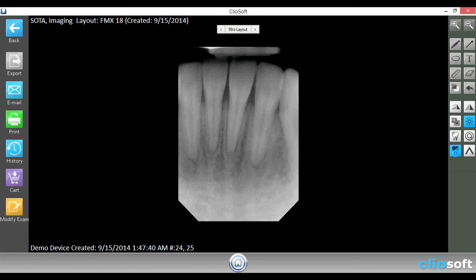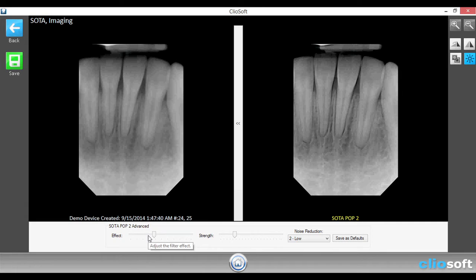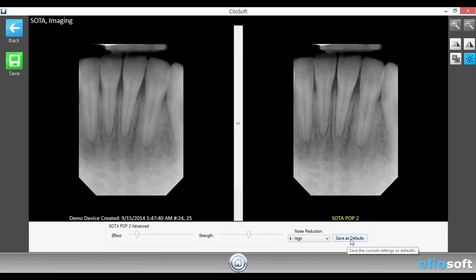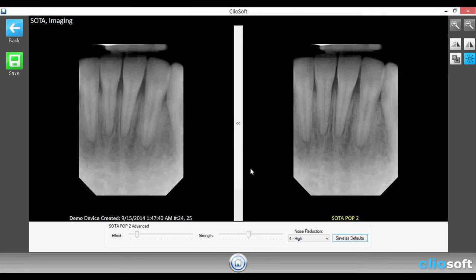We can also apply a filter to this image. Now let's say that this filter does not come out very well — we can customize the effect and strength of that filter. Once we hit that button, we'll notice that the raw image is on the left and the filtered image will be on the right. So let's decrease the effect and increase the strength, and let's put the noise reduction to high. And let's save that as the default, so now those settings will be applied to every single image that we hit for the filter.